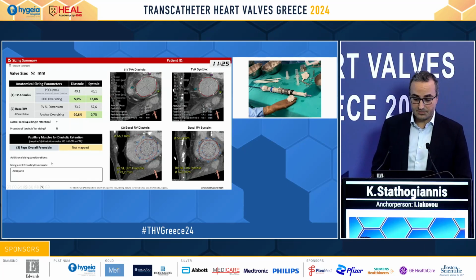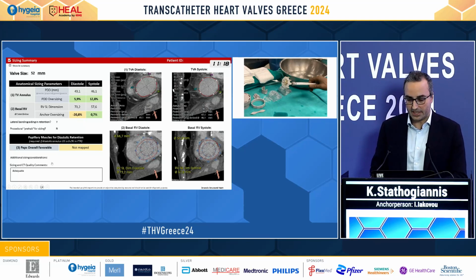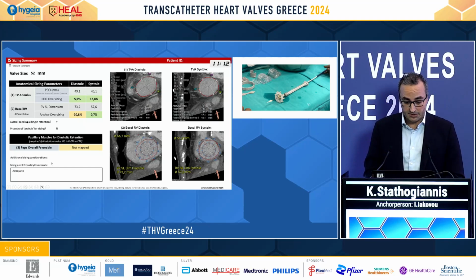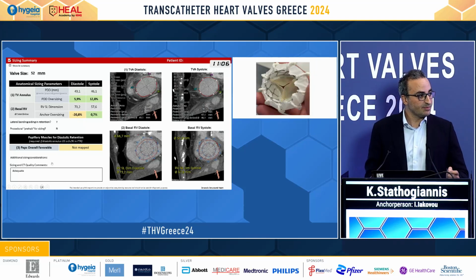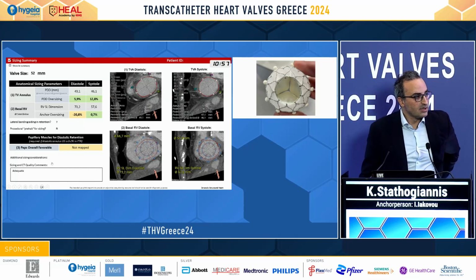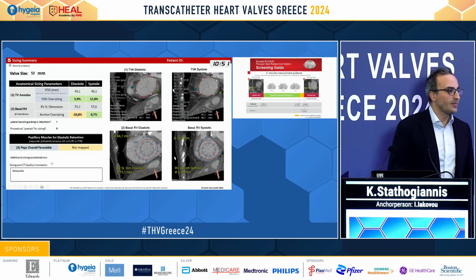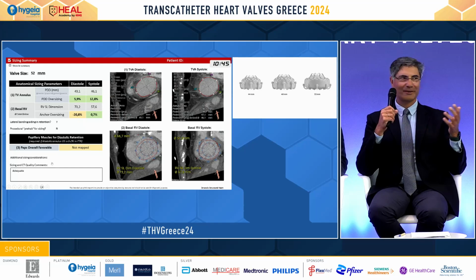As we are evaluating these patients, we're very fortunate to have very detailed measurements. And of course, we don't know beforehand what kind of procedure or what kind of device we're going to choose, but the companies do send back their reports. So considering that this patient, maybe, Chairman, just before we decide which kind of therapy, repair or replacement, before I go into some details for the Evoque valve. It depends what kind of arms you have, right? Up to now we had only TEER, but now it seems there is a new armament. So it's the TTVR, right?